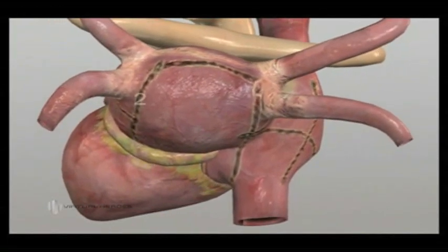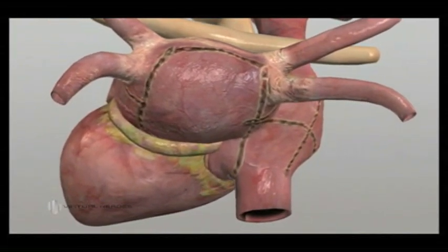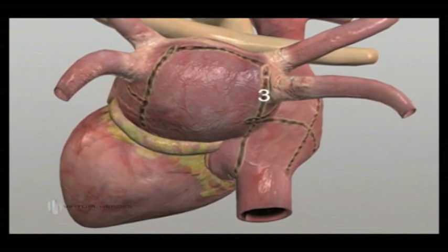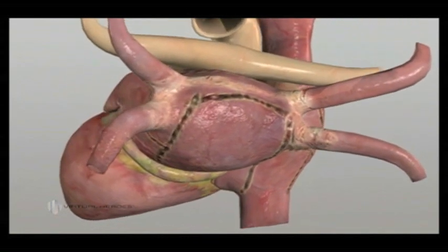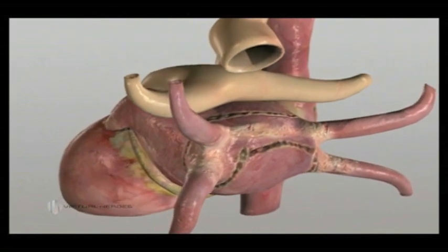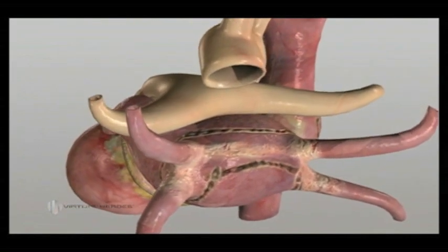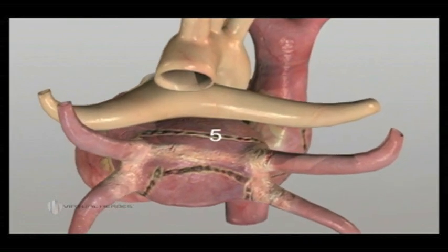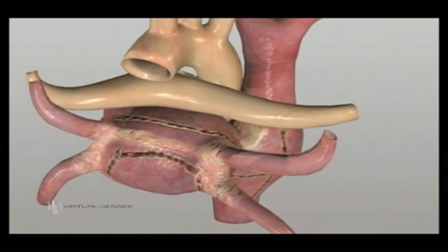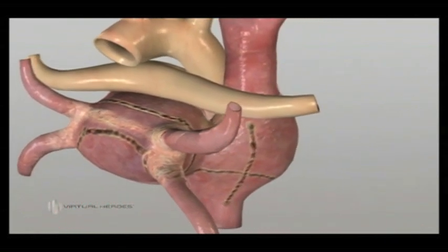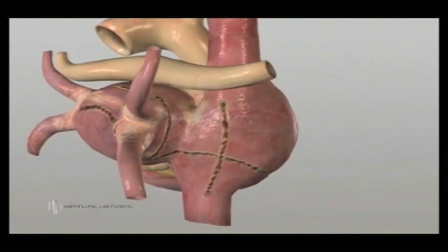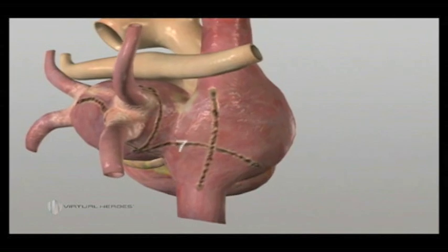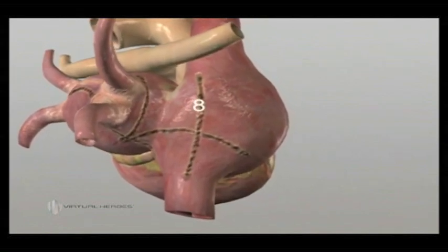This animation demonstrates the seven lines that are made with the N-Contact system by the cardiac surgeon in the electrophysiology laboratory. Both the left and right atrium receive long linear transmural burns that take care of most of the pulmonary vein isolation required for this procedure.